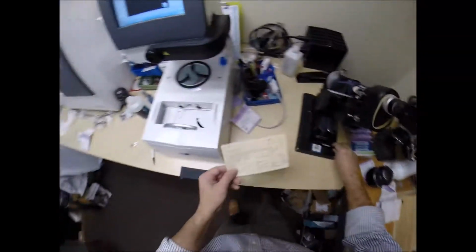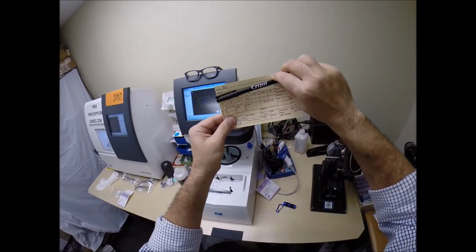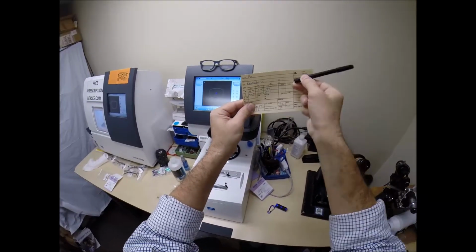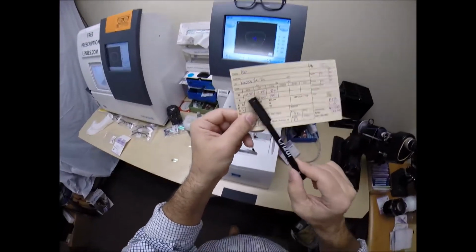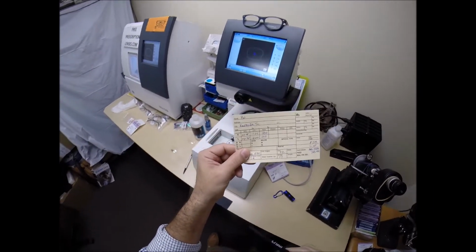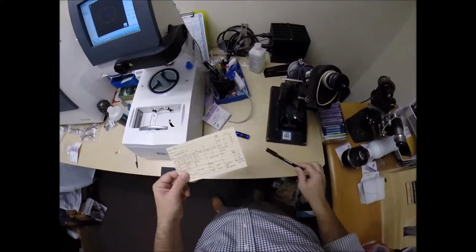Now, as I mentioned, a straight line is 0 to 180, so starting, the cap is at 0, 90 in the center, 180. We're going to turn that fine tune knob to 180. Actually, we can stay right there because it's the same number. Now for your left eye, we're just going to turn that to 10. Now the first two numbers are real values to be concerned with. This last number could be anywhere from 0 to 180. It just tells us where to find the correction. These are real values, real powers.